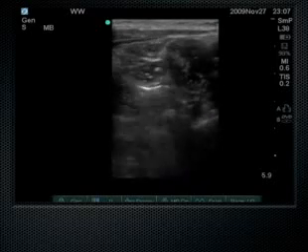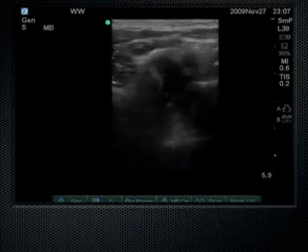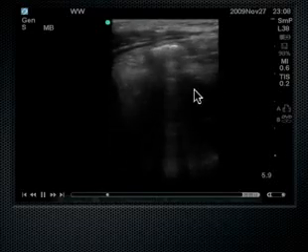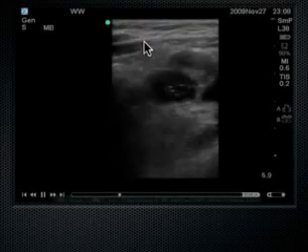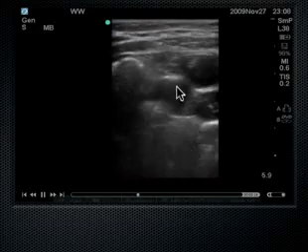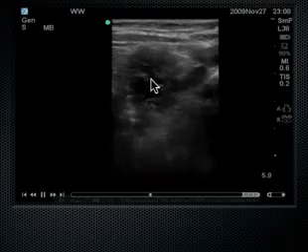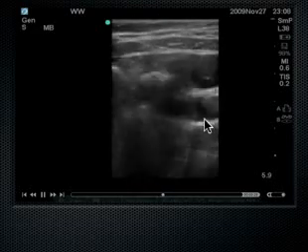Now in this case here, we're just doing a lot of compressing, and no matter how hard we compress, we're walking around everywhere, compressing. Here's some psoas muscle. Here's some bowel peristalsis with some air in it, abdominal oblique. We see loops of bowel with fluid. Here's psoas muscle right here coming. It looks like psoas is coming up this way. What's happening is we're pushing this all the way down towards psoas, right? So all this tissue is compressible. We never see the appendix.